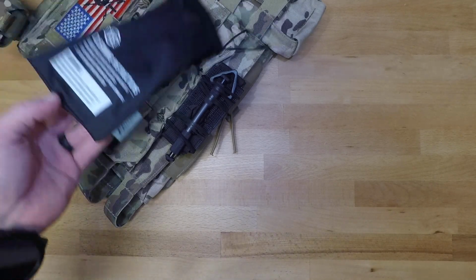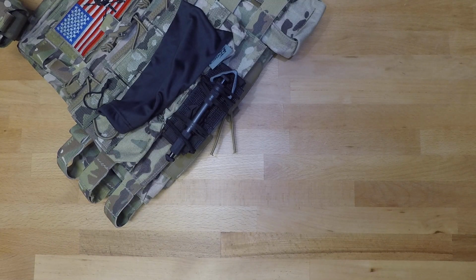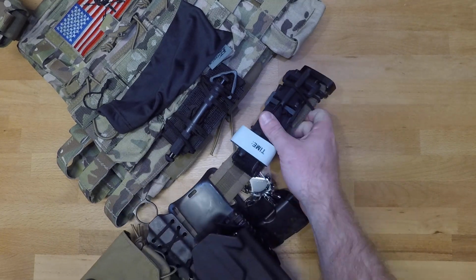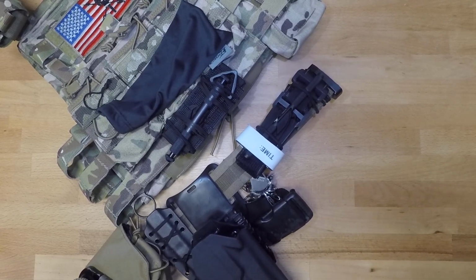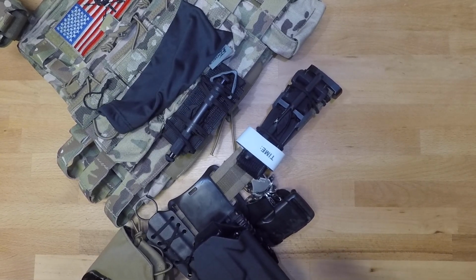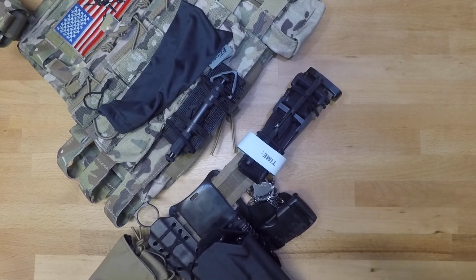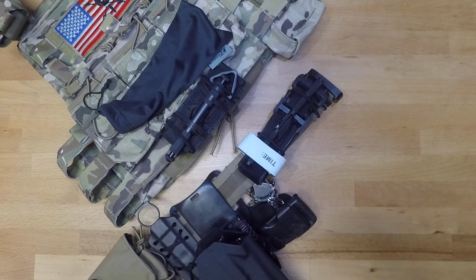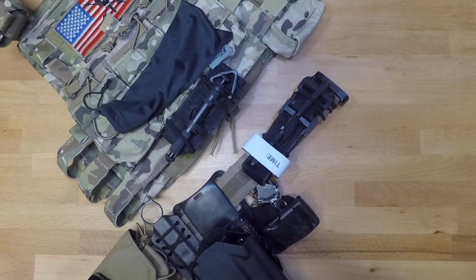Like I said, again, if you want to protect it from UV light, just use a sunglasses case. And it is simple as that. Key thing is centrally locate them. Get away from throwing tourniquets inside of pockets and all of that. I know there are a couple other pouches out there that guys are using. I would recommend staying away from those because you have to fight that pouch to be able to pull that tourniquet out typically in those cases.